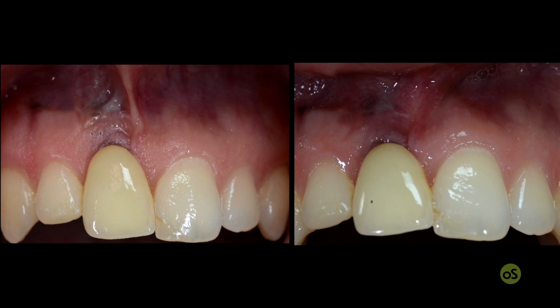This is the only way by grafting if you want to increase the keratinized tissue. And this is something that can be applied in the posterior area where aesthetic is not critical, when the position of the soft tissue margin is not critical for the patient, in which you just want to increase the capability of the patient to clean by improving the amount of keratinized tissue, but not for sure in the aesthetic areas.